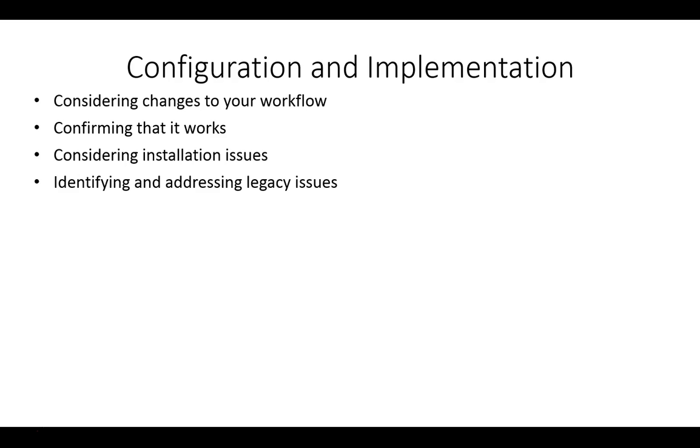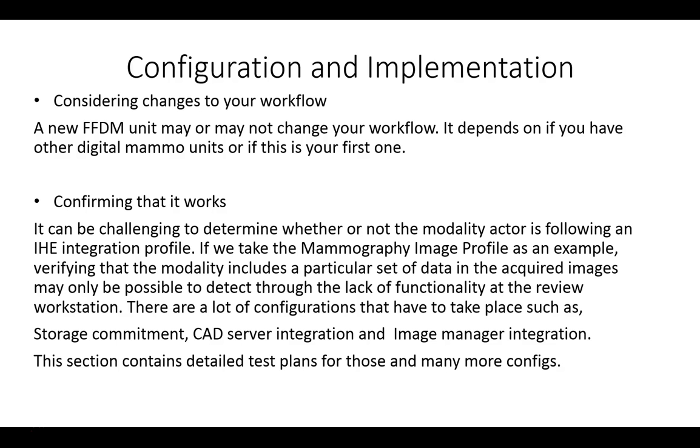Configuration and implementation has 4 basic sections: considering changes to your workflow, confirming that it works, considering installation issues, and identifying and addressing legacy issues. So, for considering changes to your workflow, a new full-field digital mammo unit may or may not change your workflow. It depends on if you have other digital mammo units already or if this is your first one. So it's hard to know what the changes to your workflow will be, but there are several parts of this section that will give you some ideas depending on which case matches what you're doing at your hospital.